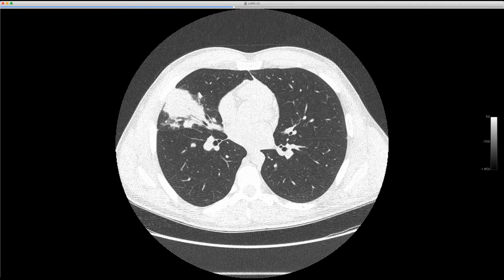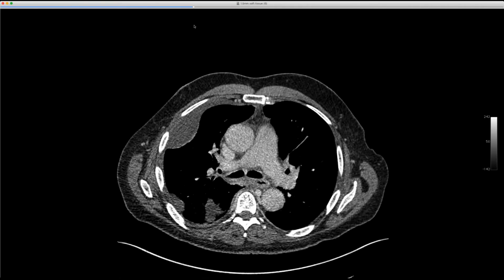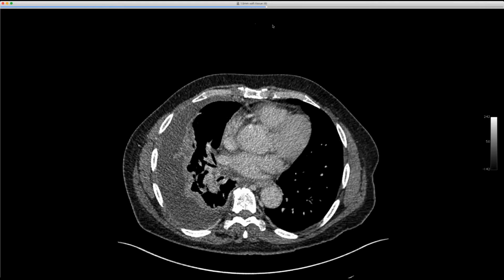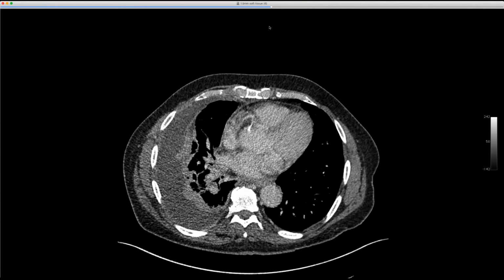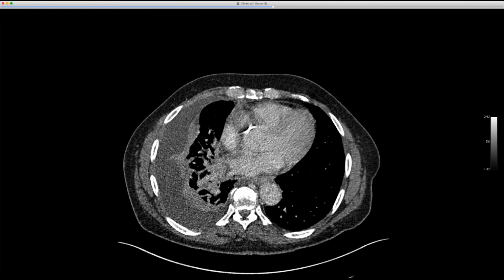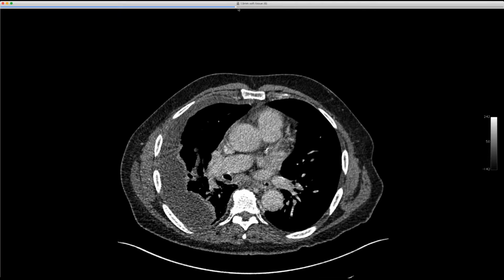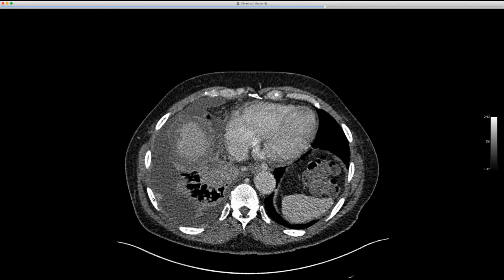So this is just one example of blasto, but I wanted to contrast it with this because this is an unusual manifestation, and I got to show you the CT here. This guy was otherwise healthy and developed fever and cough, was treated as an outpatient for, quote, pneumonia, didn't get better, and comes in. I don't have a radiograph, unfortunately, but with this CT, which looks like a complicated pleural collection, right? We've got lung stuck adherent to it, irregular margins, suggesting there are probably some adhesions or septations in it. And this looks like a typical empyema. And if we go down low, he's got a little enhancing nodule in his pleural space.